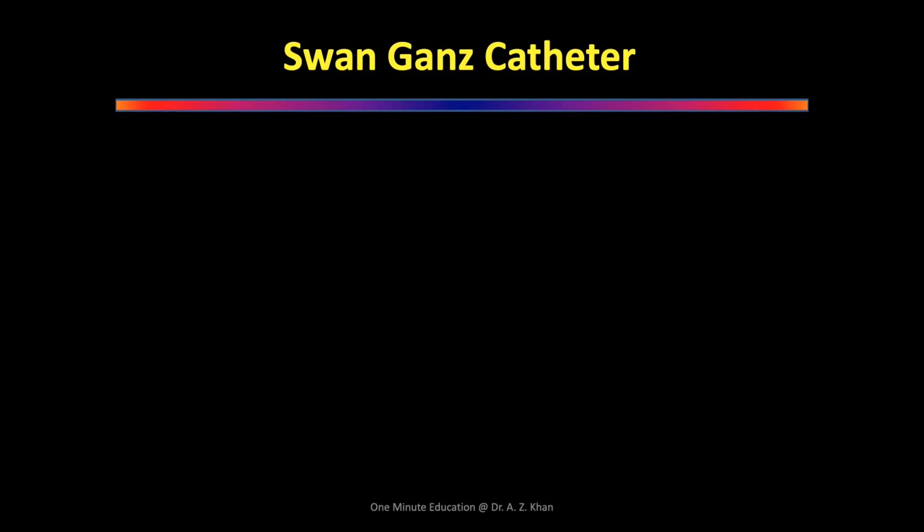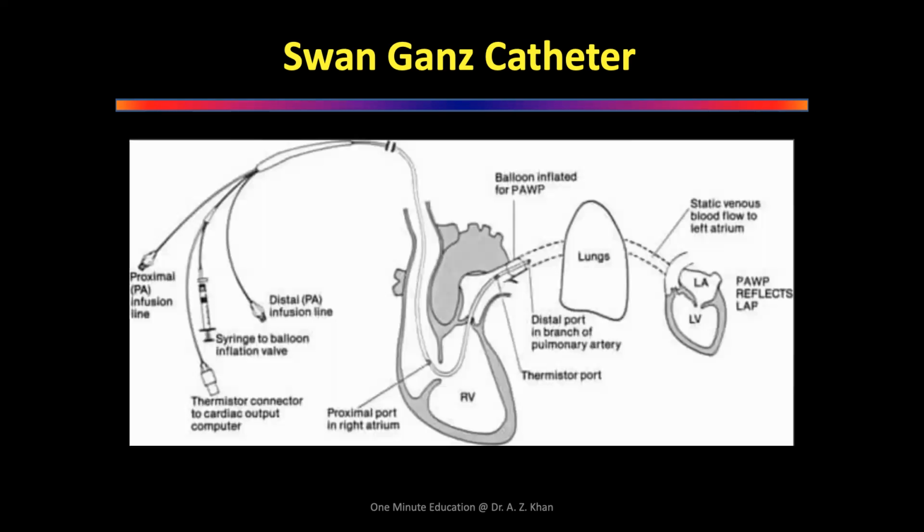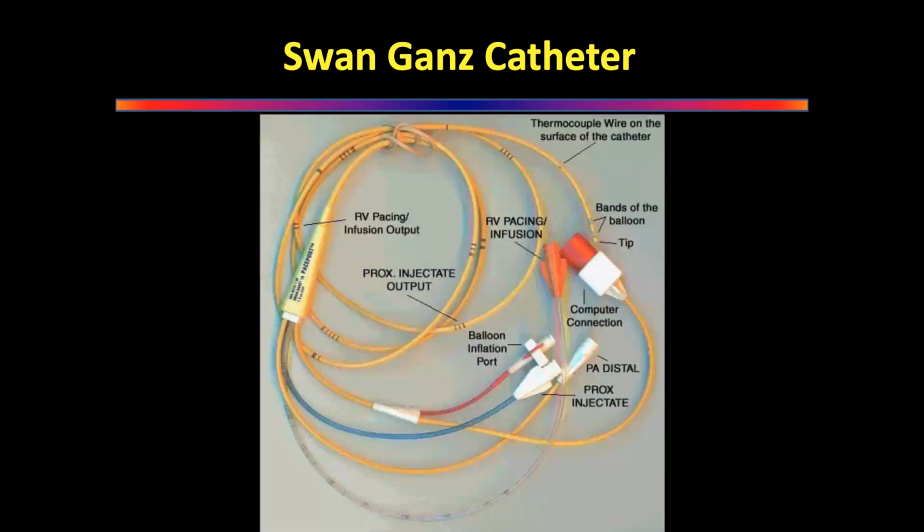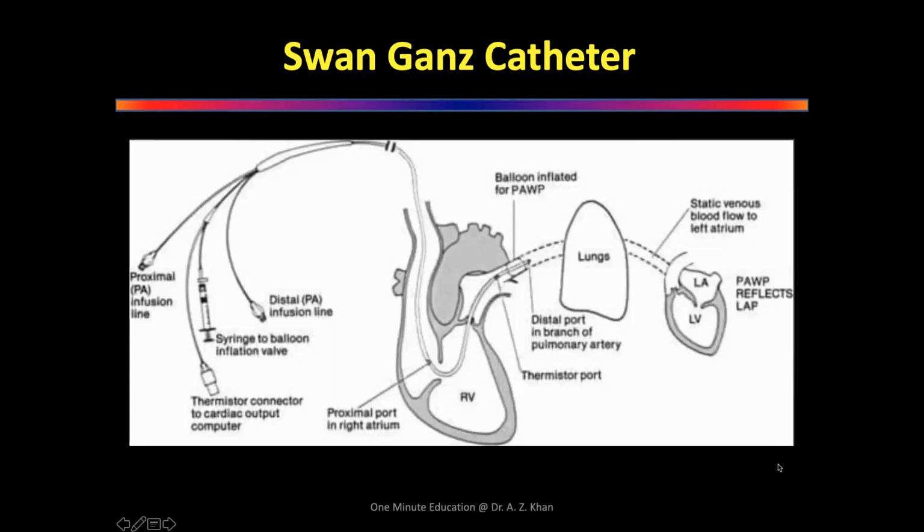We insert it, going through the chambers of the heart to the pulmonary vessel through the valves, and every chamber has different pressures and different tracing. So we recognize with the tracings where we are, and when we went into the pulmonary capillary, then there are 3 ports, I think I remember. So for the pulmonary capillary wedge, 4 ports. RA and RV, so 4 ports.